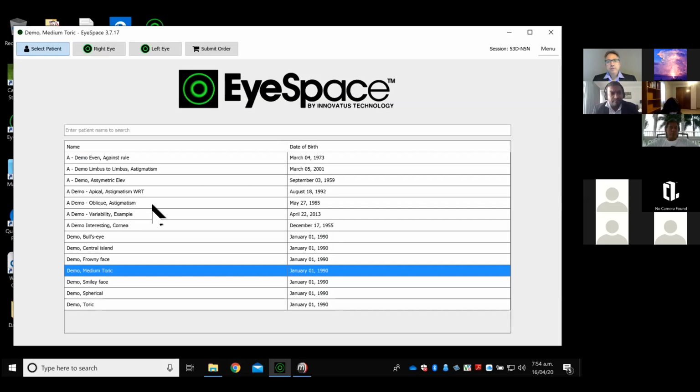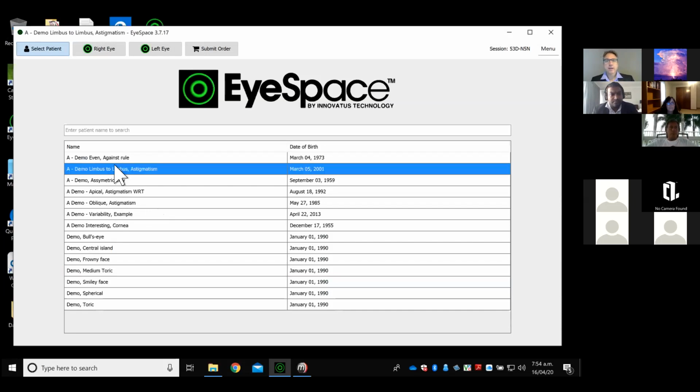You can modify the lens for basic keratoconus fitting, but you have to do that in association with a known fitting set. The moment we're dealing with irregular corneas, the spectacle prescription becomes unreliable, and therefore you have to have some form of diagnostic fitting lens on the eye to get certain fit parameters, which you can then feed into EyeSpace, and the software will from that point onwards calculate the final optics of the lens.